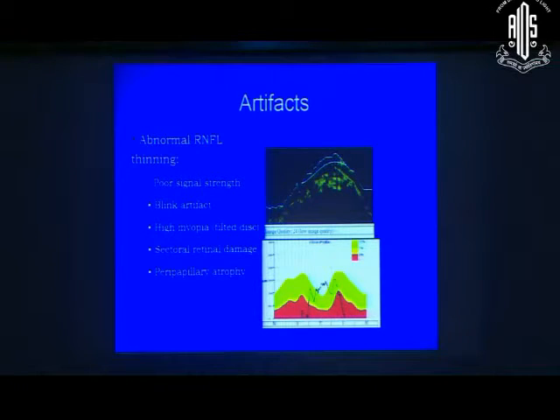You also get artifacts which look like this. And when you look at this map, that looks like a weird black line which is going all over the place. Now this can be because of poor signal strength, it can be because of a blink, it can be because of high myopia or it can be because of sectoral retinal damage like a scar or something of that sort. So if you see that black line hitting 0 anywhere, you need to take a closer look at that scan because the RNFL thickness never drops to 0 because you have supportive tissue.